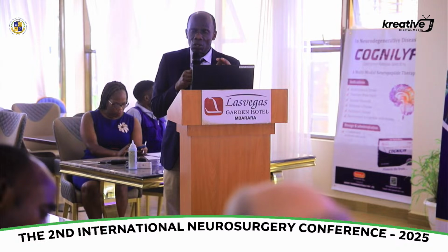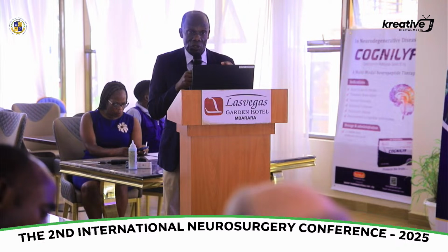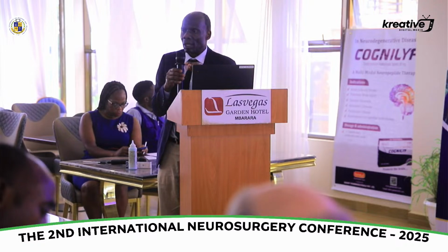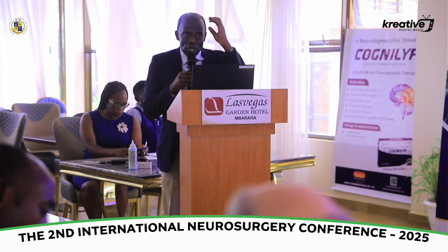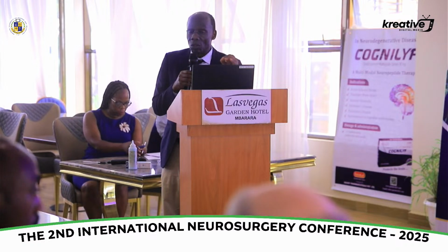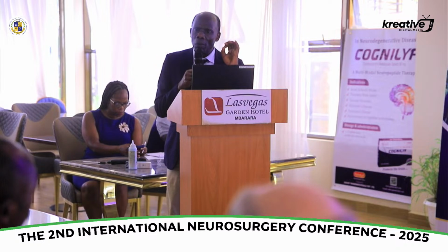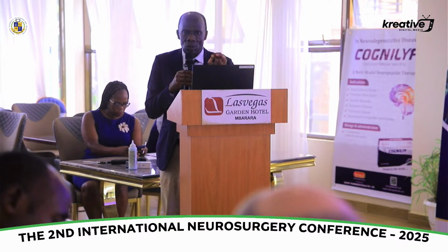It is going to be very useful for us to monitor patients who have got infections, brain abscesses. Today, we treat abscesses by aspiration. And you can't be sure whether there is reaccumulation. And once I've created a window on the skull, then you can use ultrasound to monitor the progress of this condition. So it is not only diagnostic, but also monitoring of our patients as we have them on the ward.